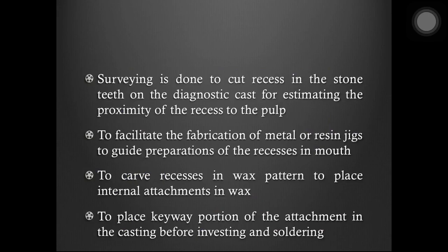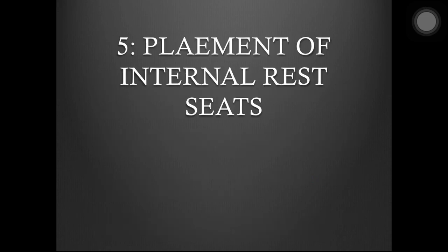Surveying is done to cut recesses in the stone teeth on the diagnostic cast for estimating proximity of the recess to the pulp, to fabricate metal or resin jigs to guide preparations of the recesses in the mouth, to place the keyway portion of the attachment in the casting before investing and soldering, and to carve recesses in wax patterns to place internal attachments.